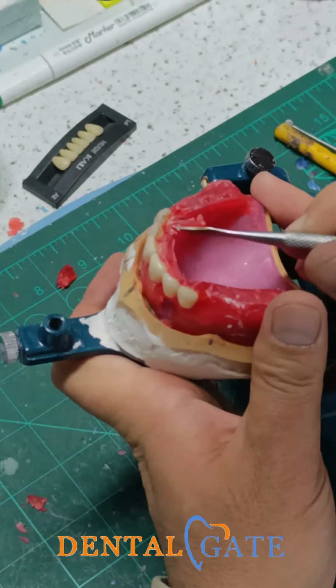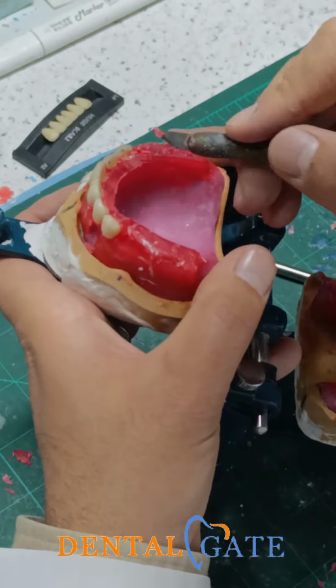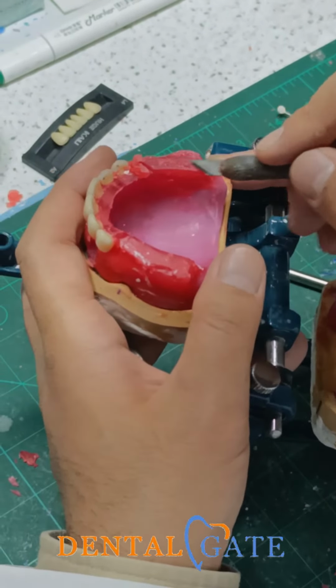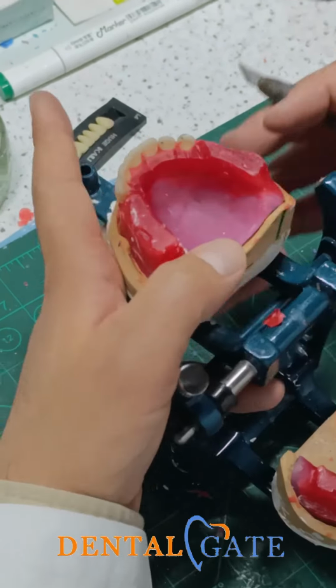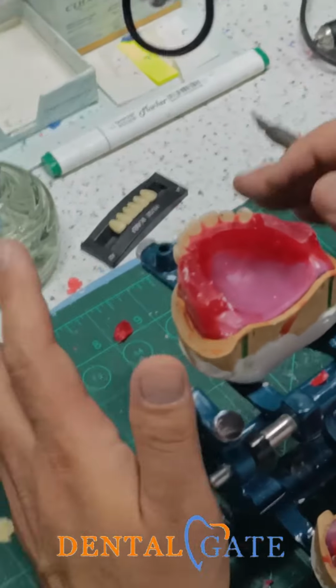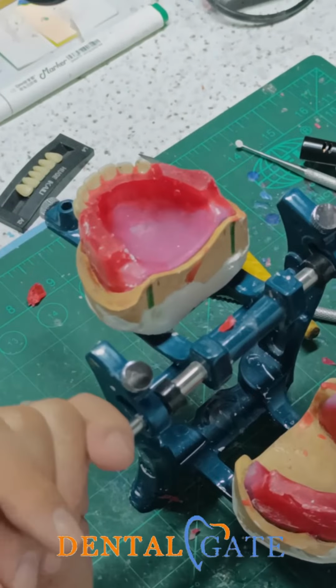Don't work with the excess of wax. Remove all of the excess wax, but preserve this portion, because I have a contact here with the lower bite. Now I will start to make the occlusion. Now the relation will start here, okay?